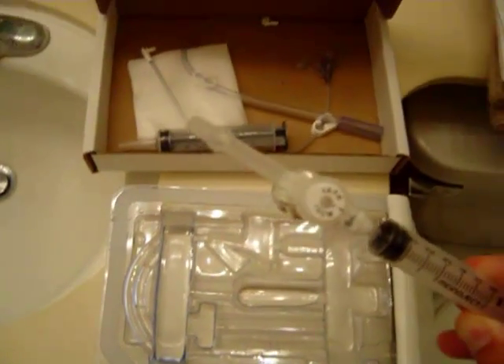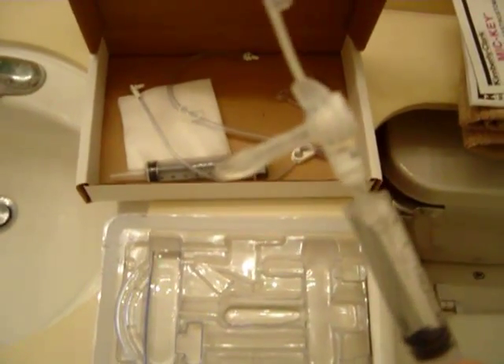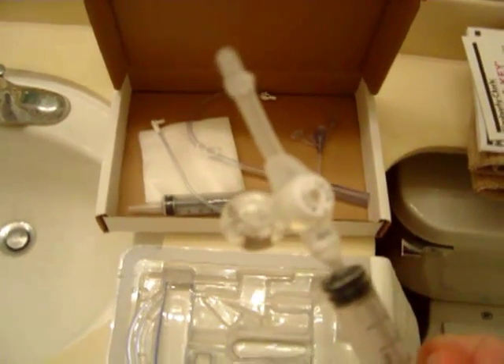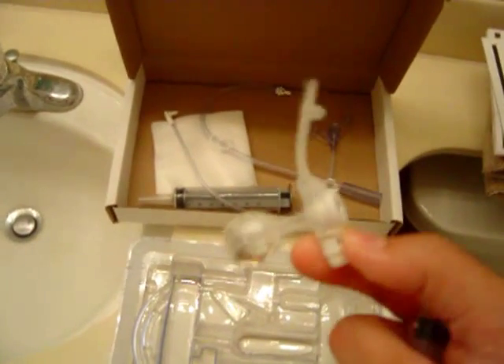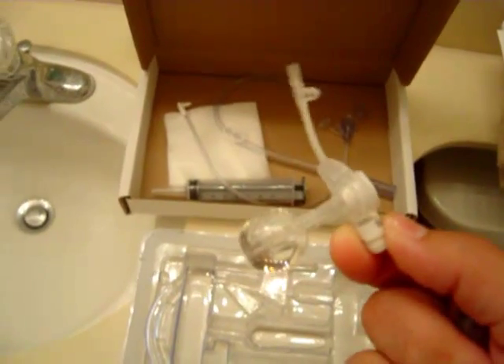You would put a little bit of lubricating jelly around the insertion point right here where it's going to be inserted, then just slide it in, inject the saline, and disconnect the syringe. Simple as that — it stays in very nicely. We like it.